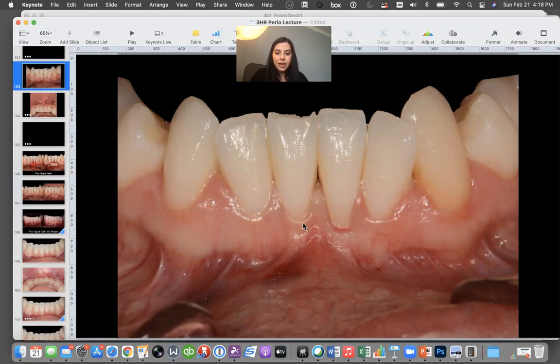What we're looking at is an area of attached gingiva. You can actually see there's a difference in the quality of the tissue right here versus the quality of the tissue right here. There is attached gingiva right here. That's attached gum tissue that is keratinized like the tissue on the outside of your skin. And in this area on 24 and 25, there is not any attached gingiva. That is why it's important to note this. In this type of gum grafted area, I would choose to do a certain gum graft, and the insurance company would choose to reimburse it if it doesn't have any attached gingiva.